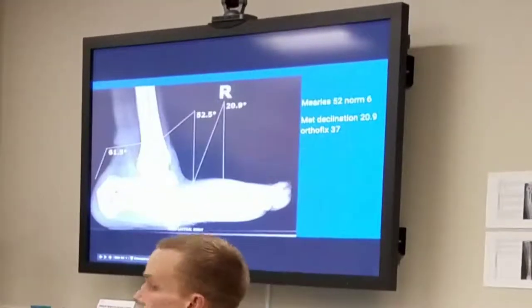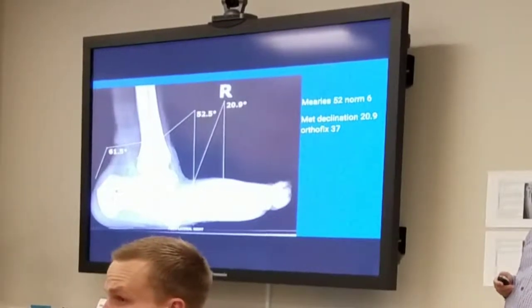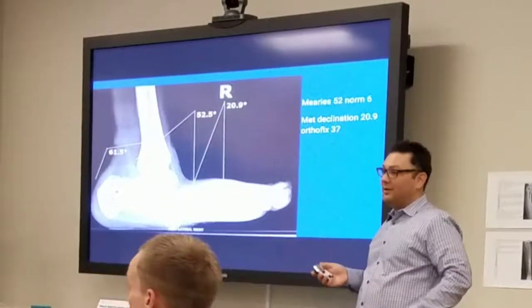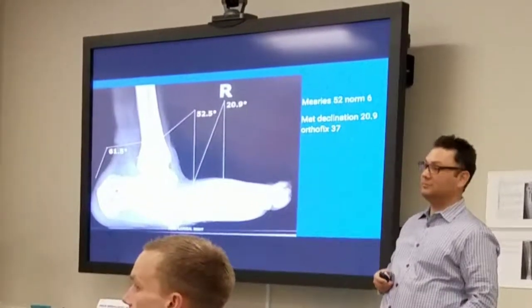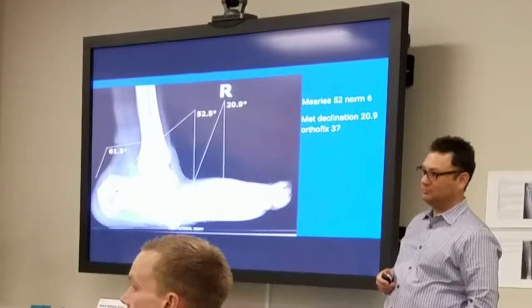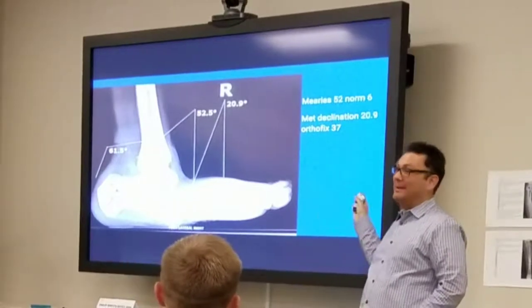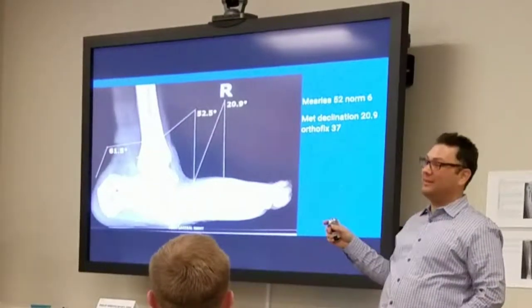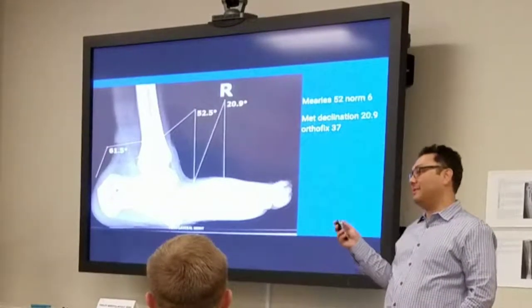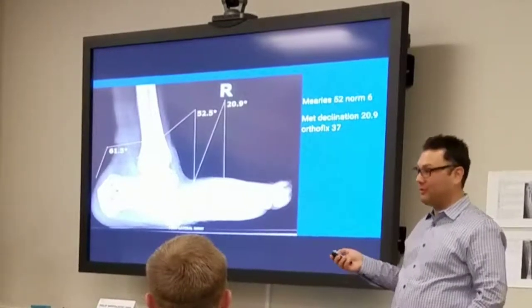Now, again, imagine the majority of Charcot cases, you're not going for anatomic reduction. You're going for a nice, graceful, plantigrade foot. Because you don't have the lever arm of the anterior portion of the calf, I just wondered if it will just pass your reduction and keep going. Look, anything could happen. It worked out well. I was concerned before I had to do the case. I told the patient, hey, this may not work. I may have to go in and do a posterior ankle release, because there's a lot of contracture over there.